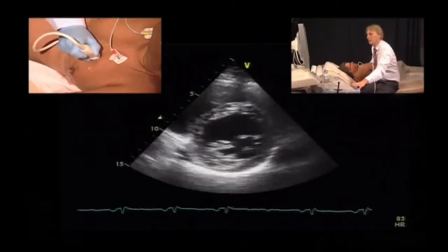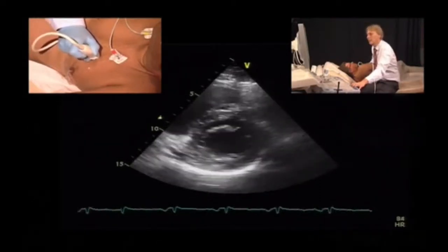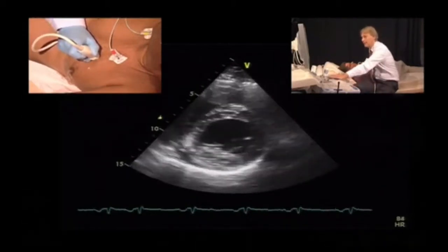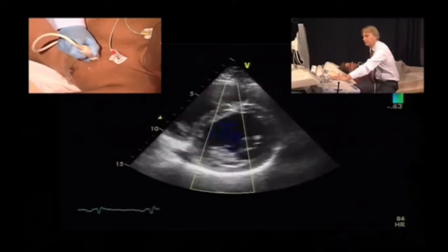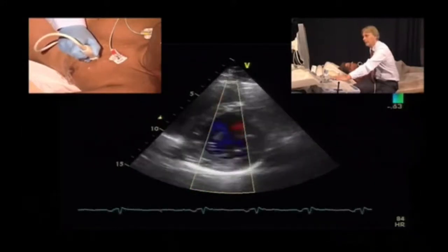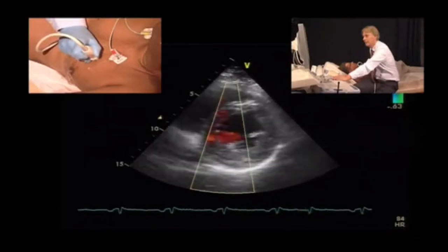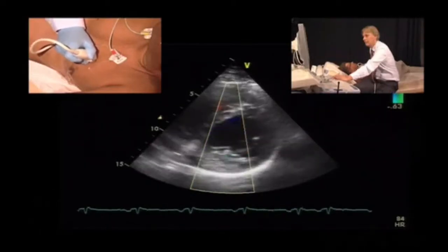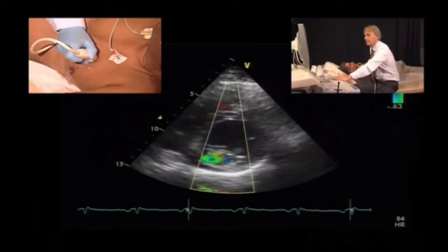First, I'd have to image the mitral valve so that I can see the anterior and the posterior leaflet. And then I just enter the color and then scan the valve moving downwards until I see the regurgitant jet. And here it is. And you can see nicely that the origin of the jet here is truly at the posterior medial commissure and not in the remaining portions of the mitral valve.